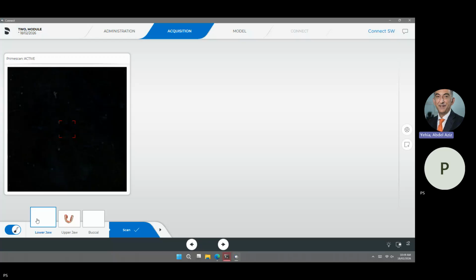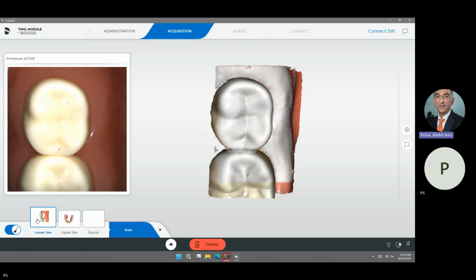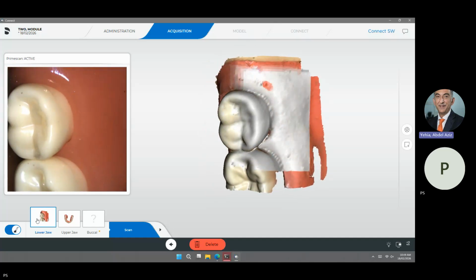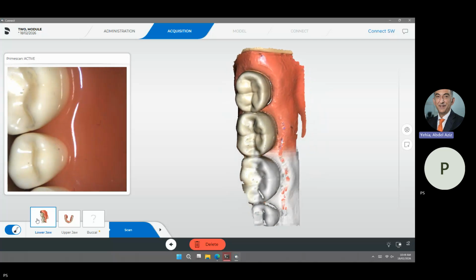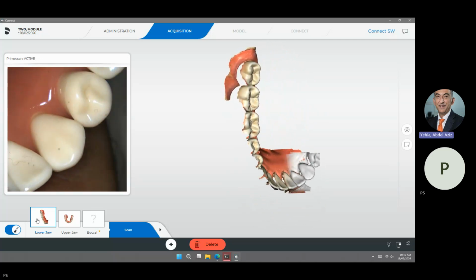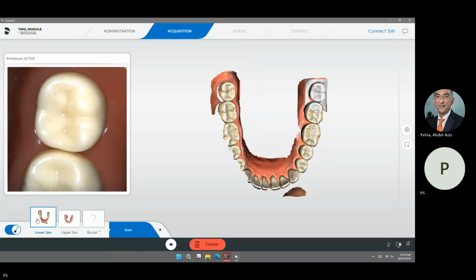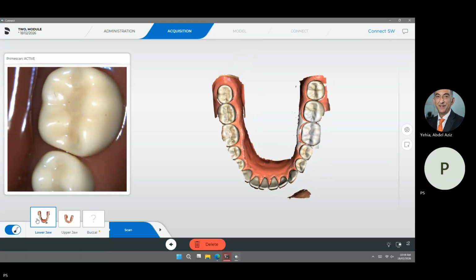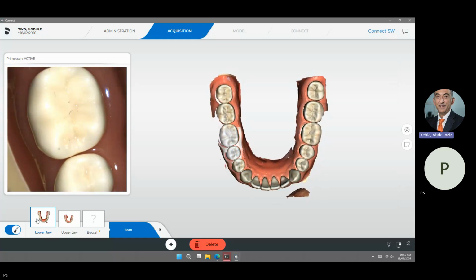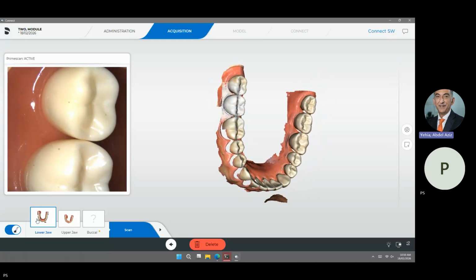and I will scan the lower jaw again, exactly in the same technique. Occlusal, last molar, right side, and then I take a whole lingual surface in one go, as much as possible. Then occlusal, then occlusal, incisal, occlusal again, and then the labial I'll divide into two halves.